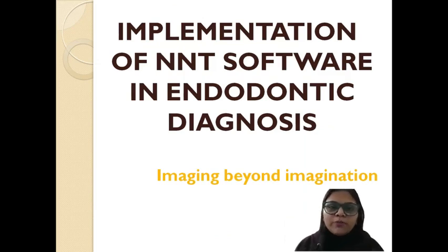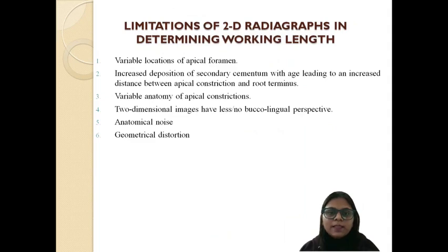So here is the topic of my presentation today, implementation of NNT software in endodontic diagnosis, imaging beyond imagination. So let's see. We all have the two-dimensional radiographs, or what we call intraoral periapical radiographs, in our routine practice in the clinics. So we determine the working length before going for the obturation and other procedures during the root canal treatment. So there are some limitations of the intraoral periapical radiograph, or the OPGs we do.